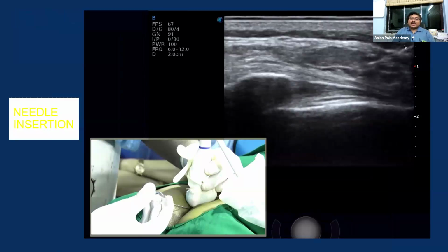For example, the epidural space has a little more vascularity. There are epidural vessels. If you put in a spinal needle, the chance of going inside the vessels is higher. And when we are doing it under ultrasound, the problem is that if it accidentally goes into a vessel, you may not be able to detect it.